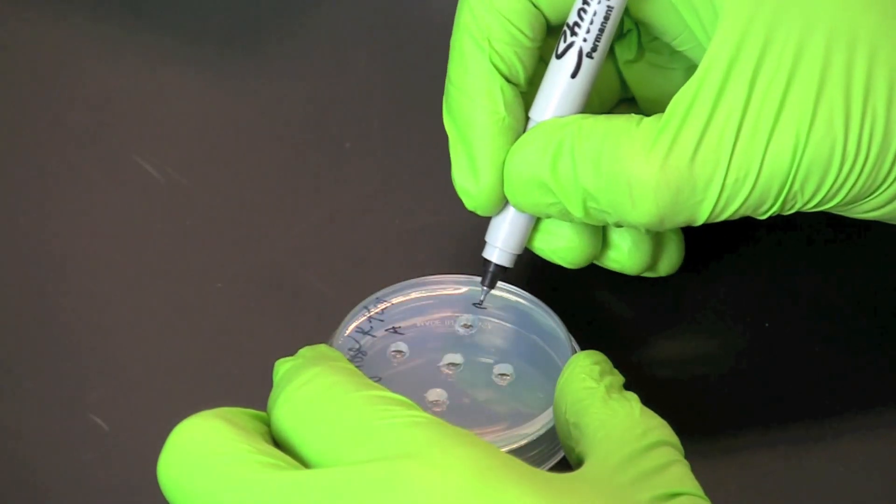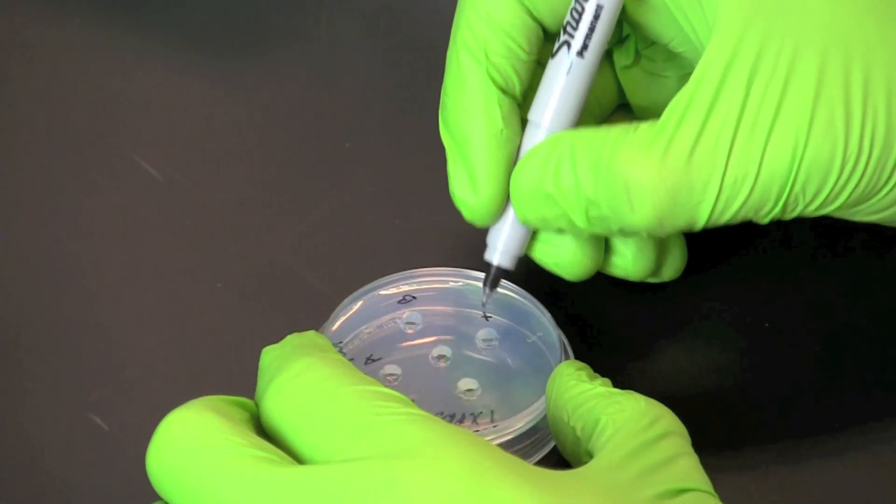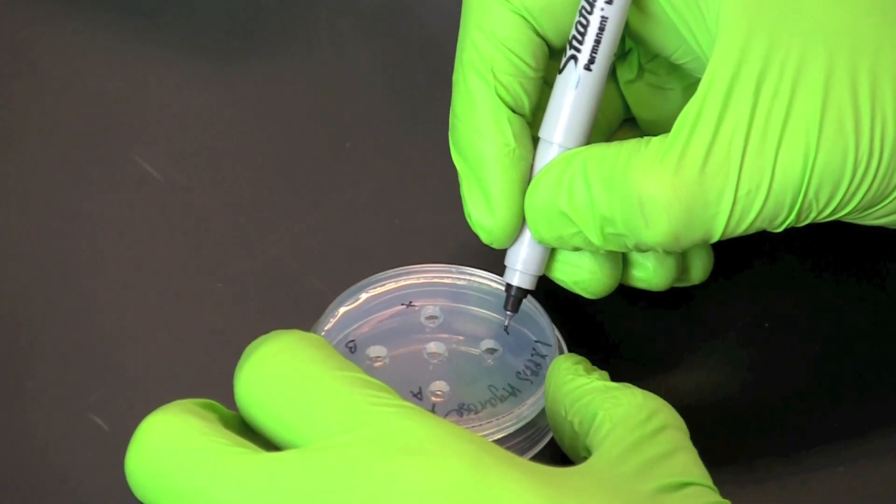Next, label the bottom of the plate for the positive and negative controls and samples A and B as shown.